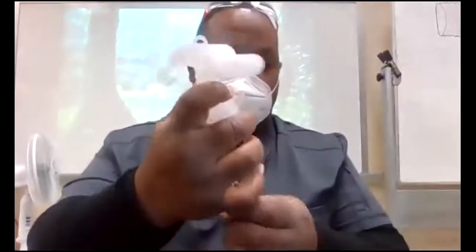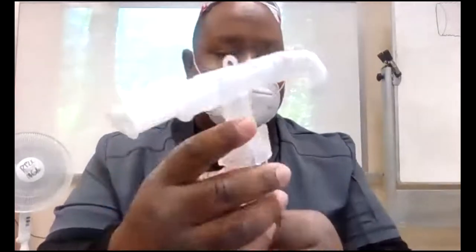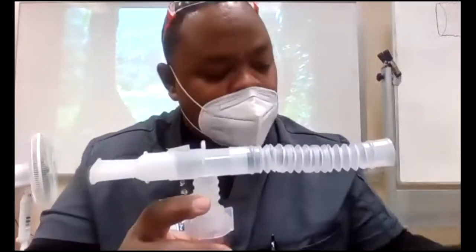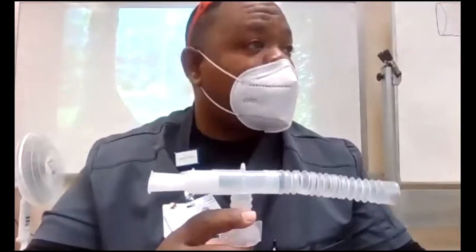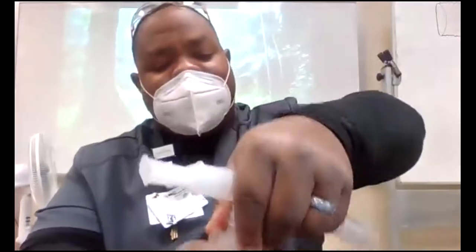Now, if I don't have my baffle, look what happens. I take my baffle out of there and put the top back on. Nothing. Not smoking. Those particles are still too big, right? Huge water particles that are not nebulizing. There's no aerosol. You have to have the baffle in order to produce an aerosol. And this baffle is built into the large volume nebulizer. There's one built up in there that does the work. But this is a small volume nebulizer that must have this baffle on the inside.